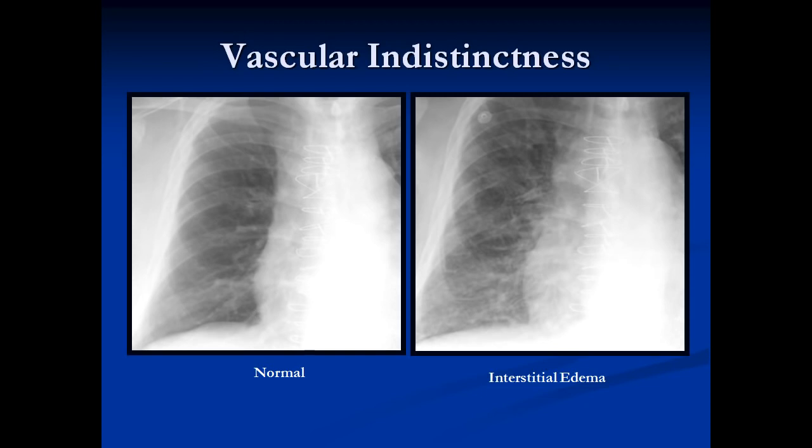We talked about vascular indistinctness — you get fluid around the vessel and around the bronchus. Around the bronchus it leads to peribronchial cuffing, while around the vessel it makes the vessel look larger and indistinct. This is the same patient — normal on the left and with interstitial edema on the right. The vessels look larger and they're ill-defined. You can't pick one vessel out over the other. This is called perihilar edema.